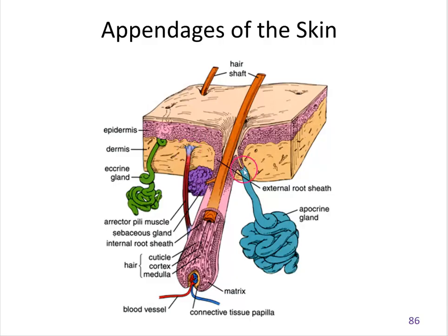The main things we're going to look at, and this drawing shows them nicely. Hair follicles, those are going to be large, and they're going to dominate the view. They will have associated with them sebaceous glands that we might see, and those have a distinct appearance. They will also have erector pili muscle, that smooth muscle that helps the hair stand up when we want the hair to stand up, so that pulls on the hair follicle.